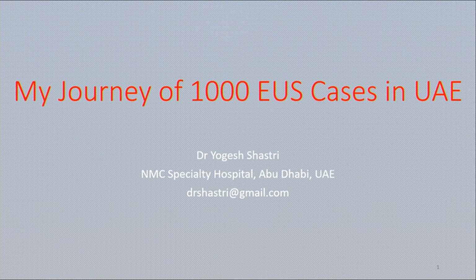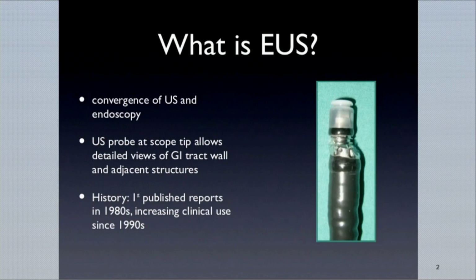Thank you, sir. Thank you for being here. So I will take you through my journey of 1000 EUS in UAE. First I would like to introduce to everybody what is endoscopic ultrasound. It's basically a fusion of endoscopy and radiology. It's a fusion of endoscopy and ultrasound.